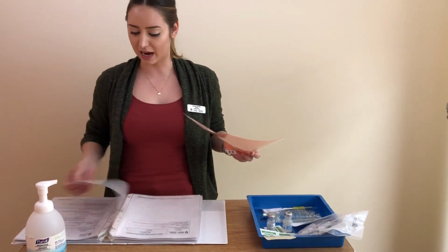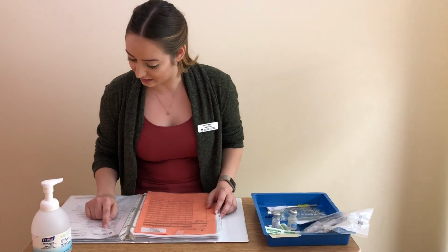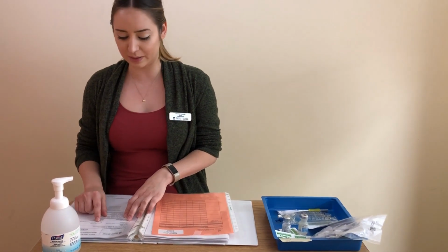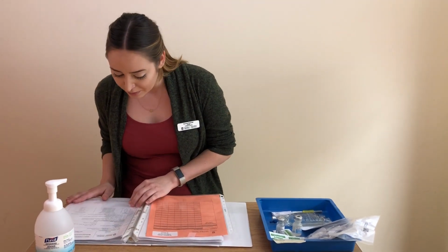Next, I'm going to go to my drug monograph and look at the methylprednisolone. It is a steroid, and it can be administered by a nurse or a student nurse, so I'm okay to give it. The usual dosage is 40 to 250 milligrams IV every 6 hours. I'm giving 75 milligrams, so that's right in the middle of that, so that is safe to give.